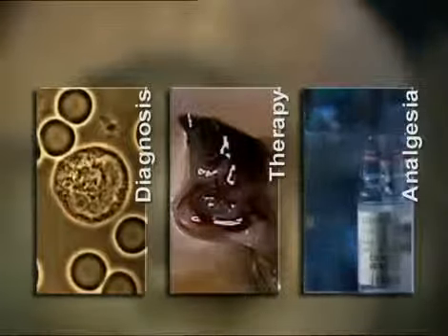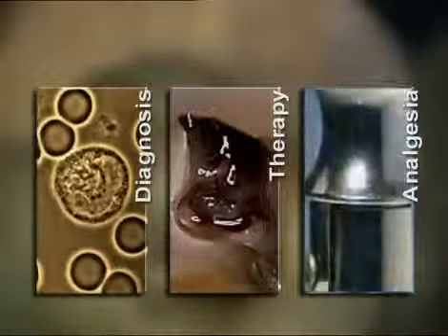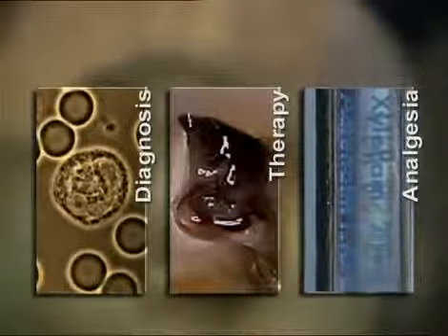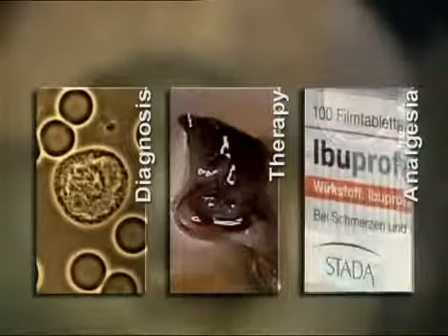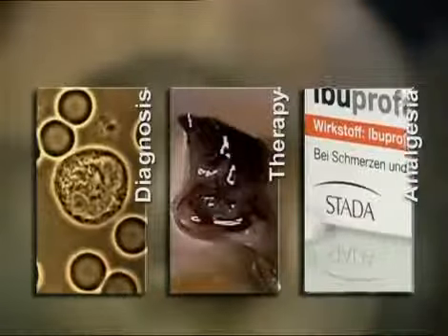Our patient's pain control is achieved by the infiltration of 2 carpules of 2% lidocaine with 1 to 100,000 epinephrine. The patient takes 1 tablet of ibuprofen right after the dental treatment.